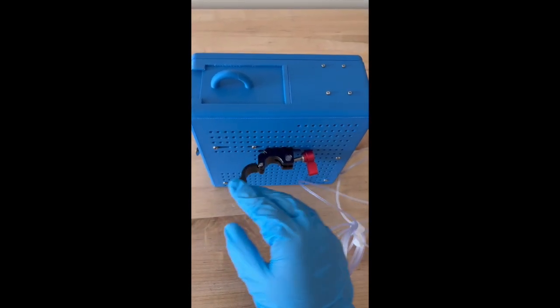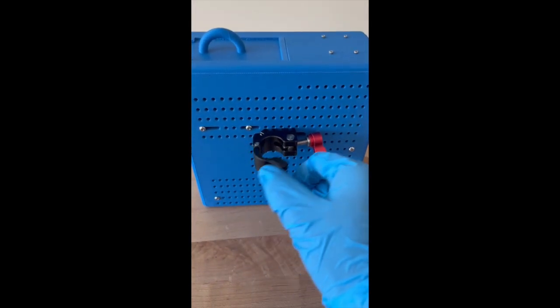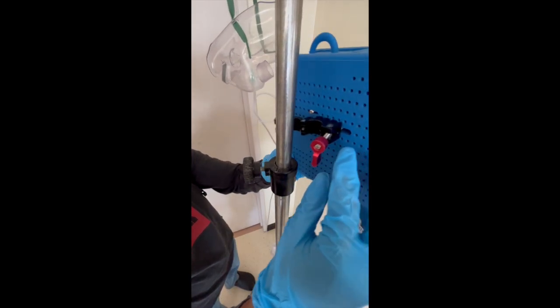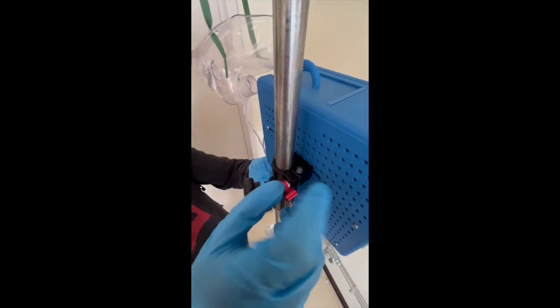On the back of the 3D printed casing, we have a clamp that opens up completely, makes it much easier to put onto the intravenous or IV pole. The mounting of which is shown over here enables us to use the device during transport of the patient into the ICU or PACU.